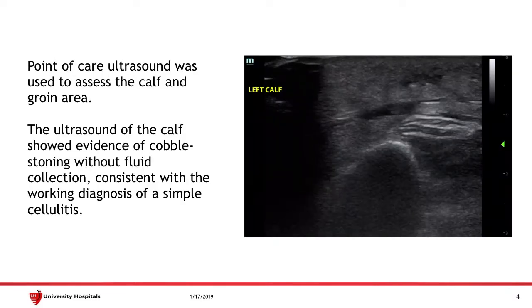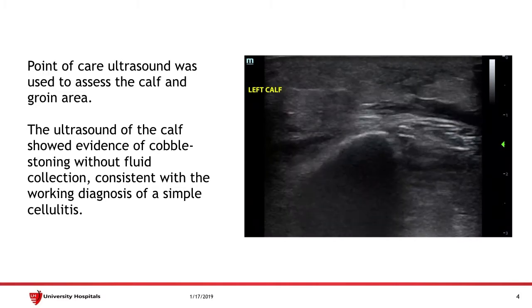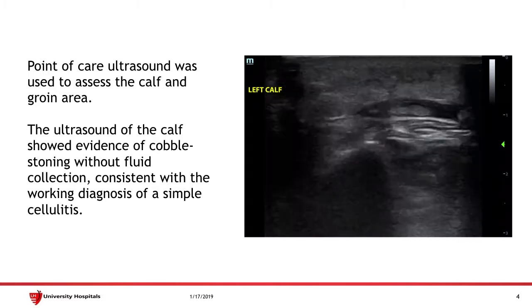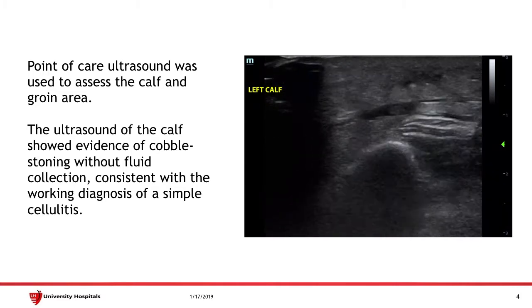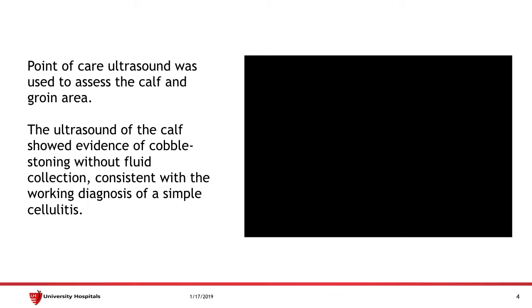We used point-of-care ultrasound to assess these areas. The ultrasound at the left calf showed cobblestoning without any fluid collection, consistent with our working diagnosis of a simple cellulitis without any abscess.